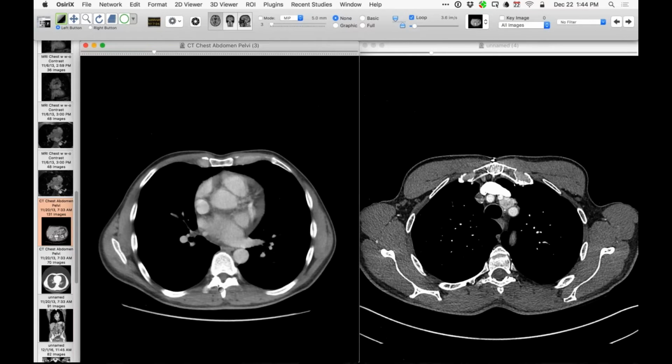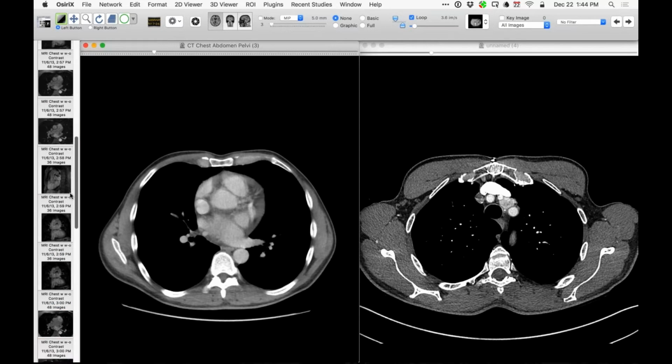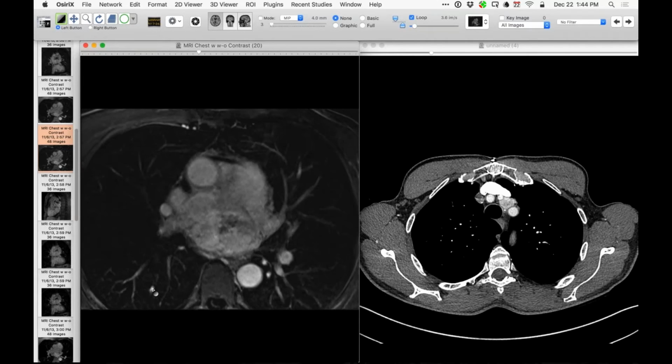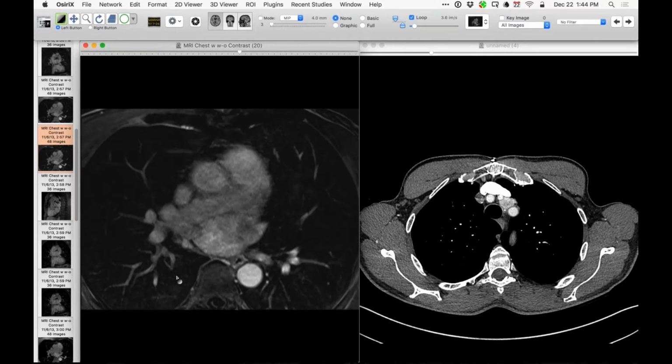Oh, I don't know. You see mediastinal varices do that. So, when you've got vascular things going around, they'll sometimes find pulmonary veins to drain into. Let's see if I have any more images from 2013. There are MRs there, so I didn't show you that. But I can look later to see if I see any veins. I don't know if that will help or not, with respect to this thing down there. Not sure.